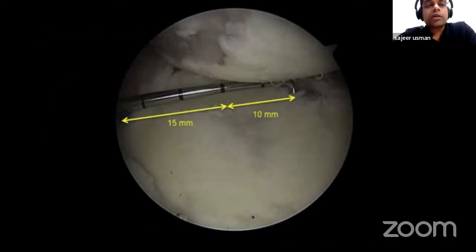So now, if you're talking about an arthroscopic assessment of the same, this is Stephen Burkhart's picture from the year 2000, where he used a graduated probe to measure the distance from the posterior labrum to the bare spot and the distance from the bare spot to the anterior labrum. In this case, particularly, you can see that 5 mm of bone was deficient.